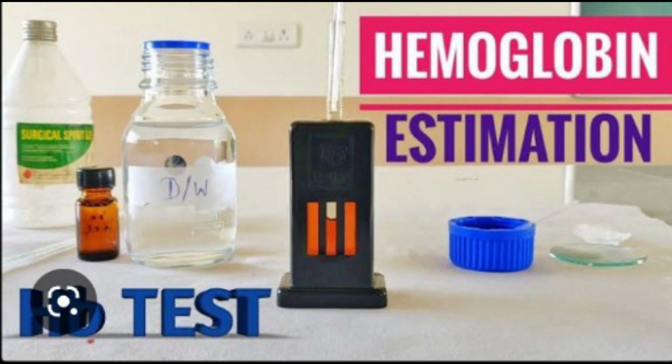Colorimetric method of Hb. It is also known as the cyanmethemoglobin method. Principle: a small quantity of blood is taken and allowed to react with potassium cyanide and potassium ferricyanide, Drabkin's solution. The chemical reaction gives a product of stable color. This product is called cyanmethemoglobin. The intensity of the color is directly proportional to Hb concentration.